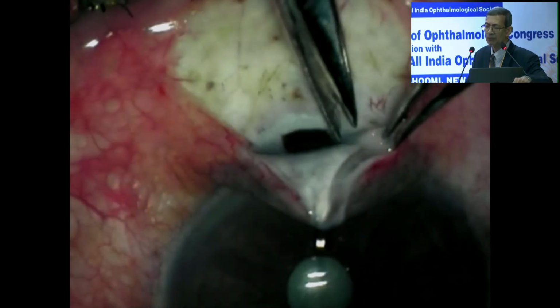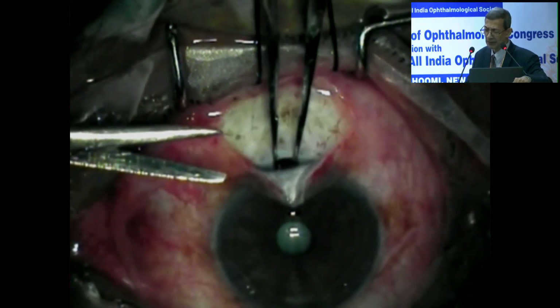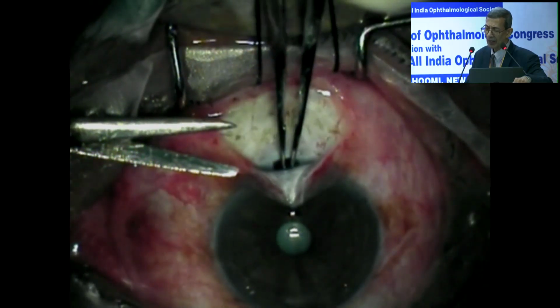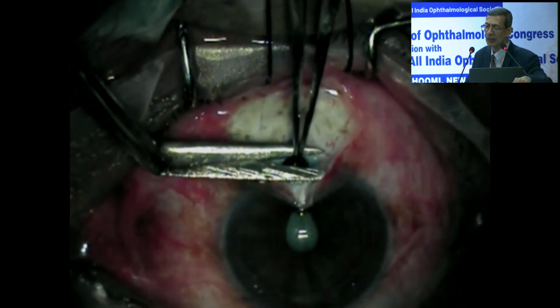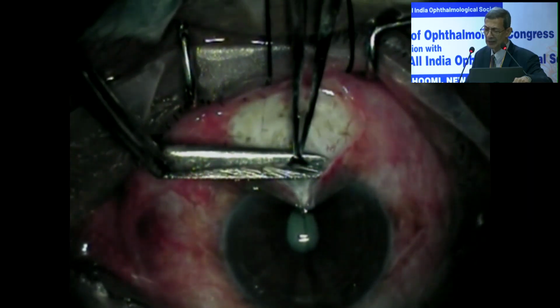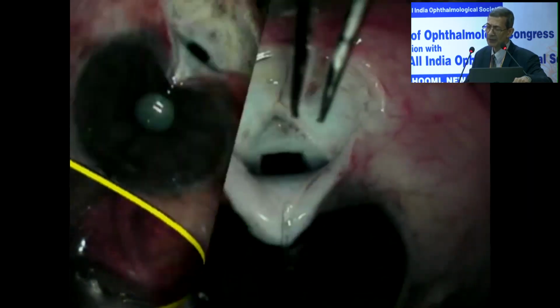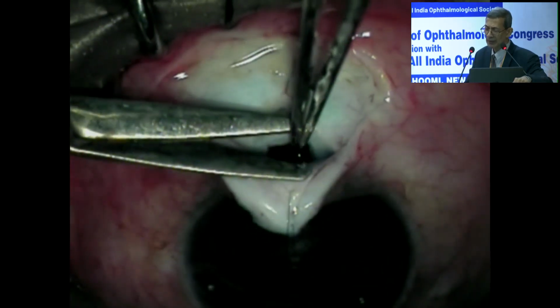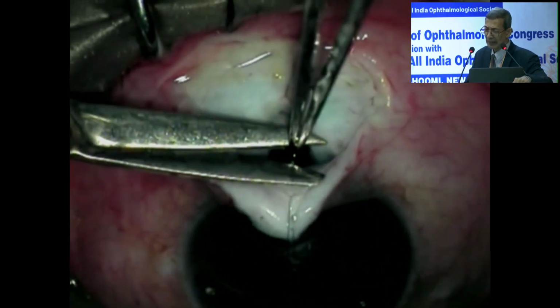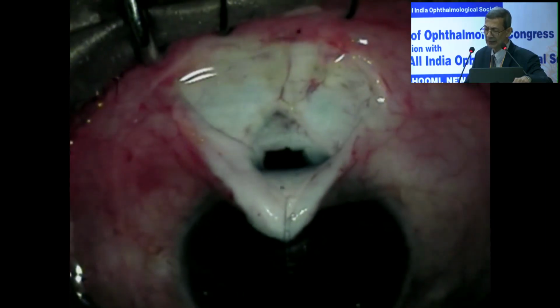One can use a punch or the way the surgeon prefers. You can see the iridectomy should be done with a base which is equal to or even a little larger than the deeper block removed. In higher magnification, it will be showing here once again the way orientation should be, that the base of the iridectomy opening is wider than the apex.